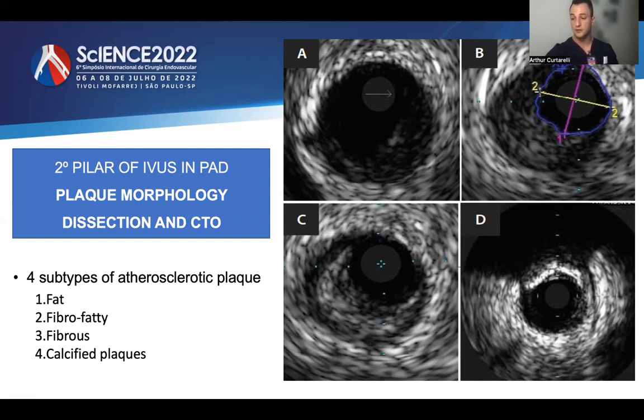Knowledge of the plaque's quality helps the examiner adequately select the plaque modification tools and the device. Plaque modification permits a less aggressive PTA, thereby reducing the risk of barotrauma and dissections of the vessel, with the subsequent need for a vascular scaffold.